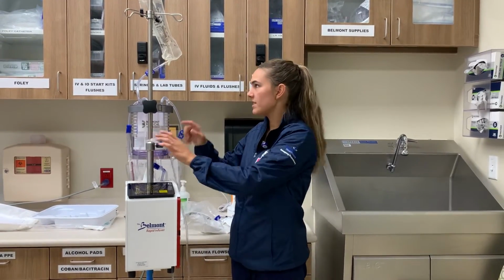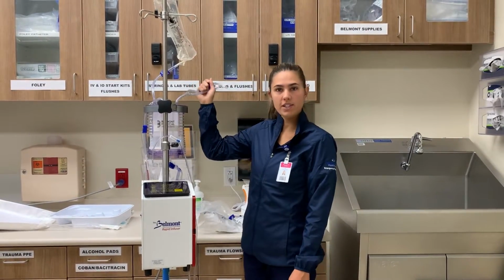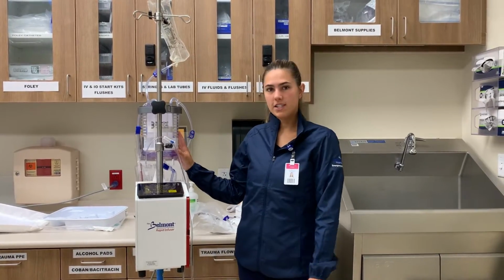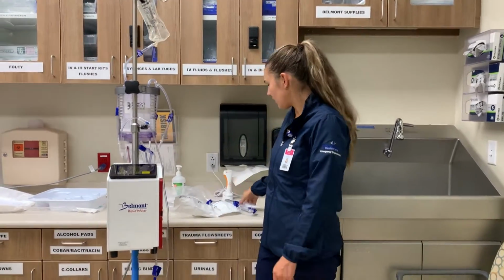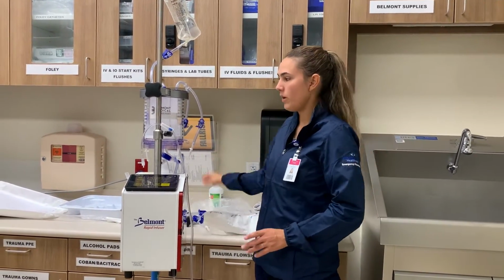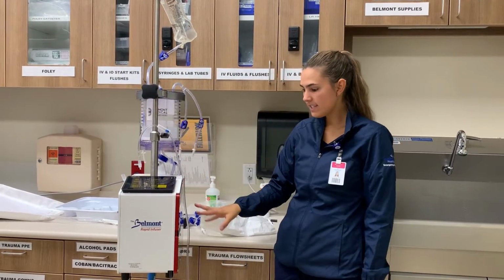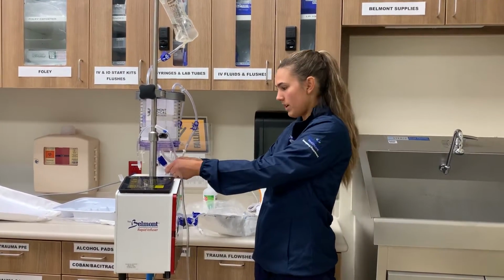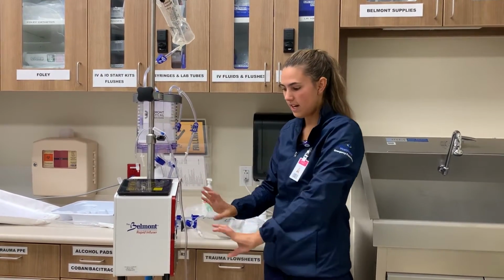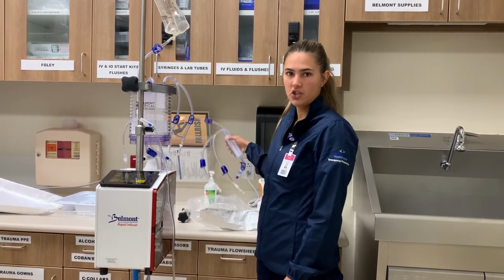At this point, the line is primed very nicely. You would connect your blood to this tubing and then you can start infusing. It's important to note also that you do not have to start with this chamber like we did. If you wanted to start with the reservoir, then you could do that. You would set up the tubing the exact same way. You would just detach the chamber from this part and you would connect it to the reservoir, and you would set it up the exact same way that I showed you when it was connected to just the chamber.